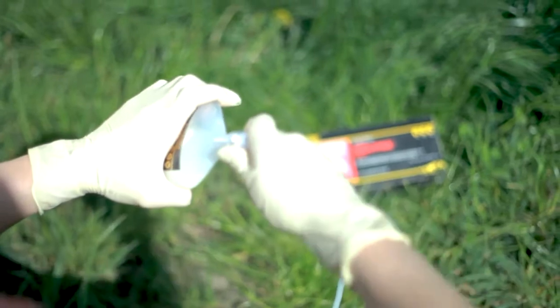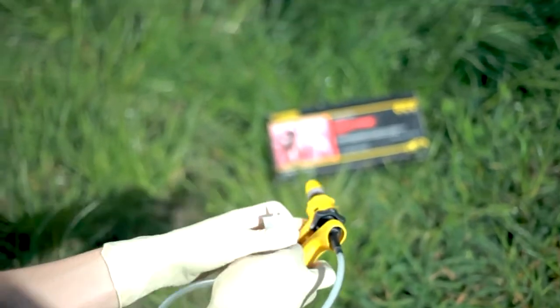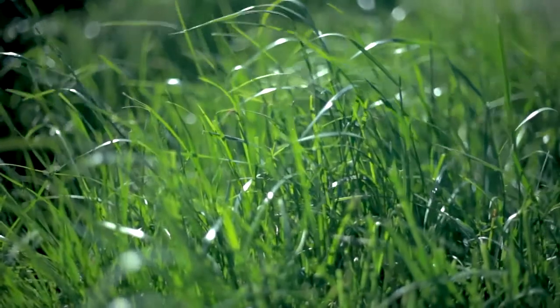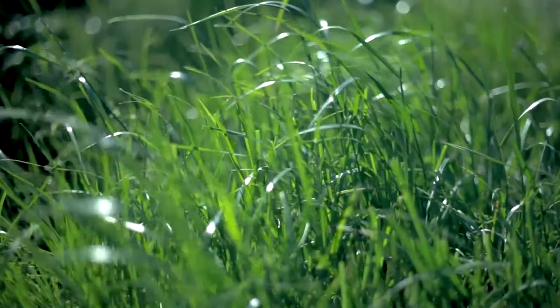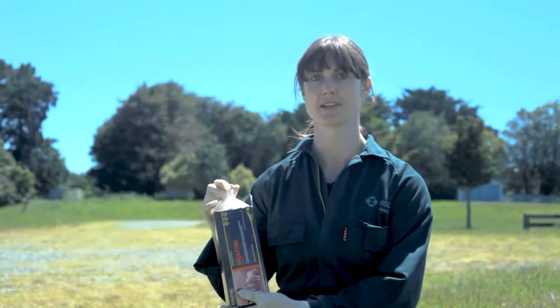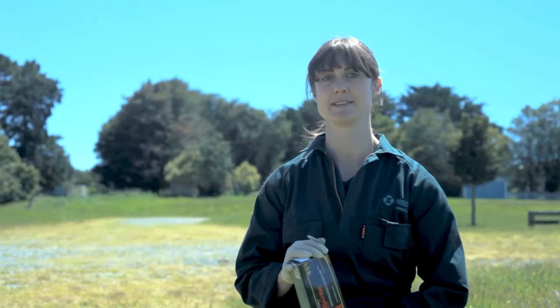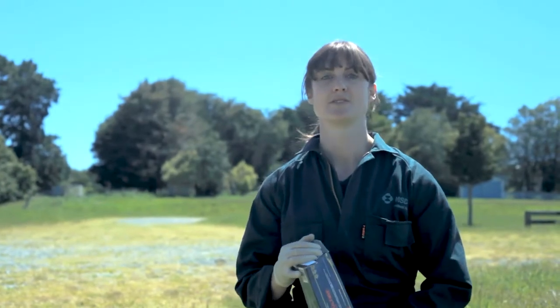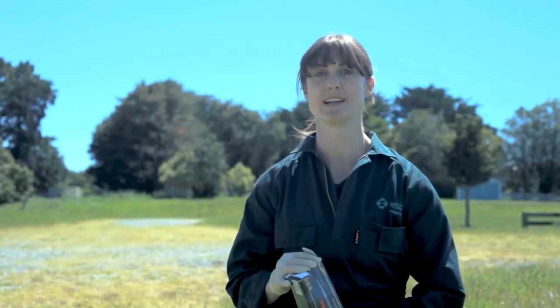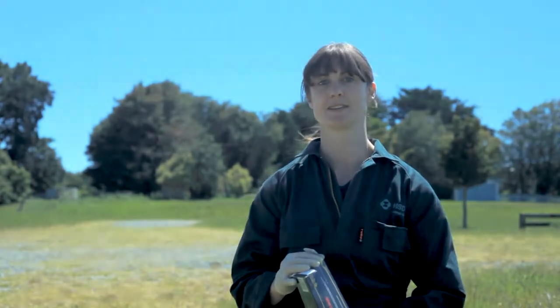To store a vaccine, gently remove the draw-off tube from the stopper and empty the tube and vaccinator gun by depressing the plunger several times. Disinfect the stopper with methylated spirits or similar disinfectant. Store the vaccine upright in the fridge in its original cardboard container and make sure the vaccine doesn't freeze. The guns, draw-off tubing and needles should be rinsed with water and then stored when clean and dry. This equipment must be sterilised prior to reuse.